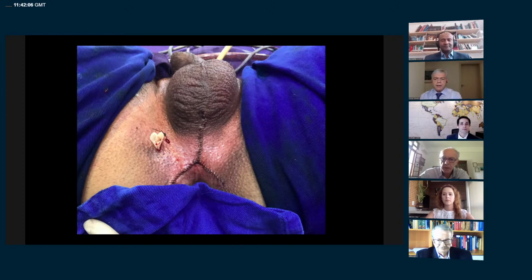Okay, nice. Professor Carlos D'Ancona, here in our service, how do you conduct postoperative follow-up of these patients? Like Nikish said, we need to perform a test before taking out the catheter to check for leakage. Now we have a project to follow the patient performing non-invasive urodynamics and to see the flow and the pressure during the follow-up at 3, 6, and 12 months. It's a new project we are studying now. It's non-invasive, and we compare the pressure and the flow to evaluate the patient without X-ray, and only this.